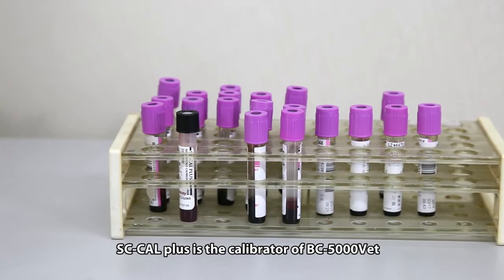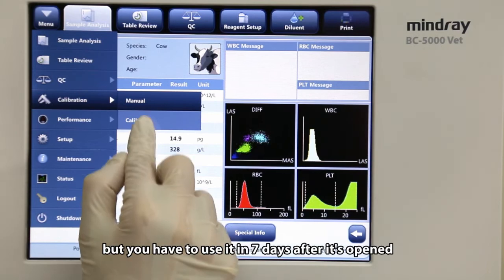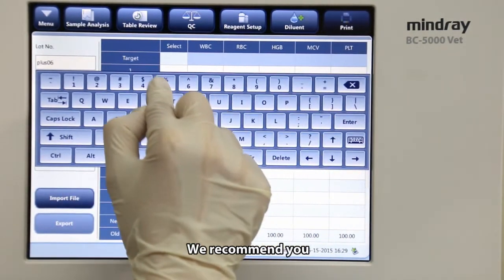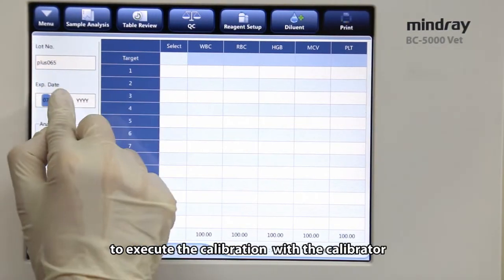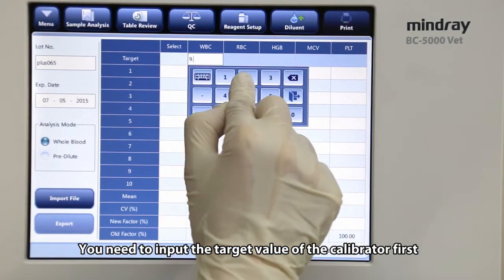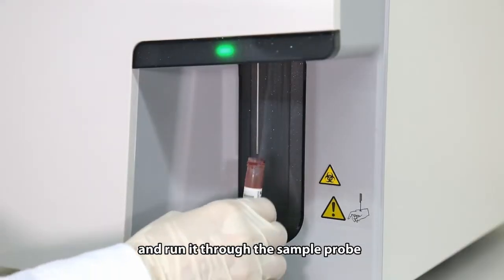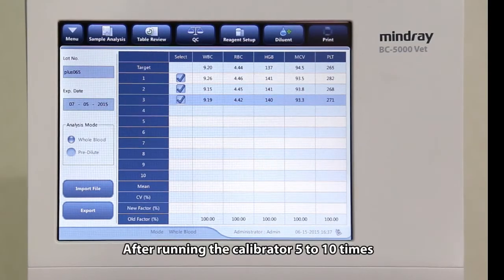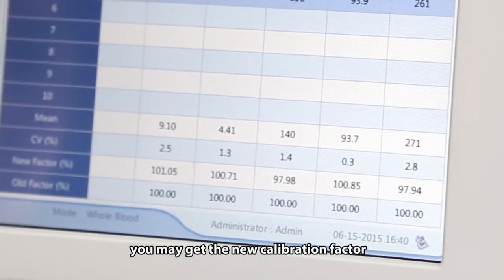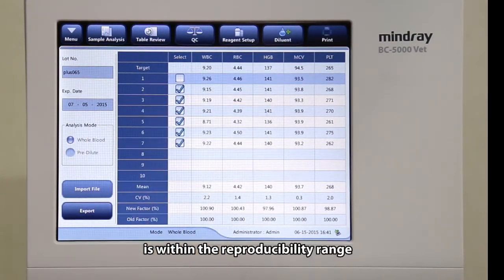SC Cal Plus is the calibrator of BC 5000 VET. Its shelf life is 1 month, but you have to use it within 7 days after it's opened. We recommend you execute the calibration with the calibrator. You need to input the target value of the calibrator first, then mix the calibrator tube well and run it through the sample probe. After running the calibrator 5 to 10 times, you may get the new calibration factor. You are able to save it when the CV percent value is within the reproducibility range.